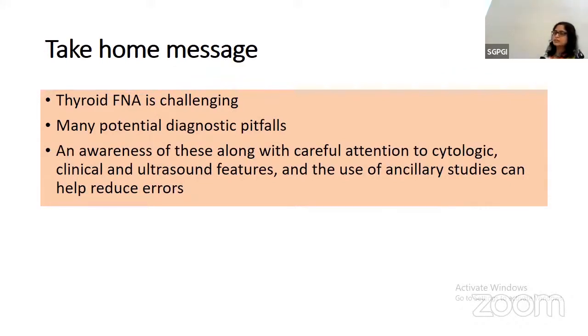And awareness of these pitfalls, along with careful attention to cytological, clinical, and ultrasound features, as well as use of ancillary studies, can help in reducing errors, as well as giving a better Bethesda classification and a guide to the clinicians of how to manage the patient.